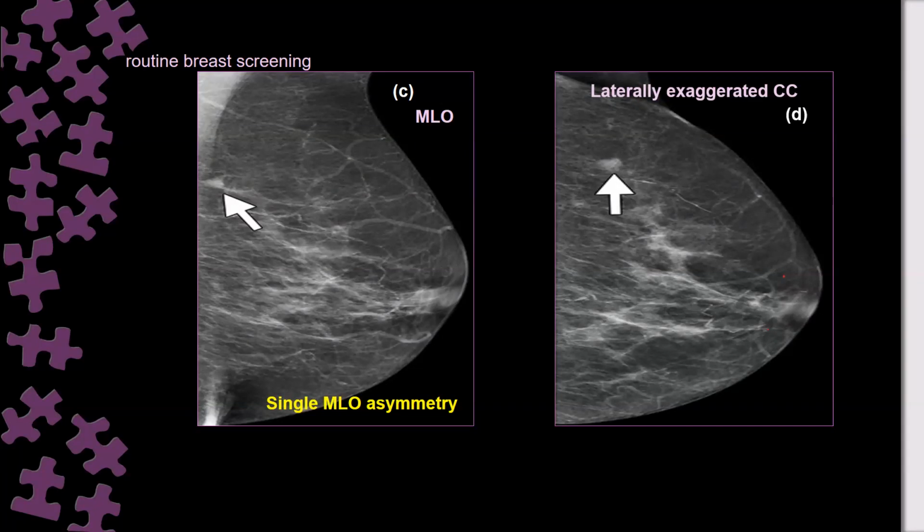I'll go just to localize it, and then I'll go for ultrasound just to reduce the mammographic images. But if I need it, I'll do it. Because whenever I do one view, I have to defend why I have done that view. Otherwise, this is additional, unnecessary radiation. We have to define ourselves.